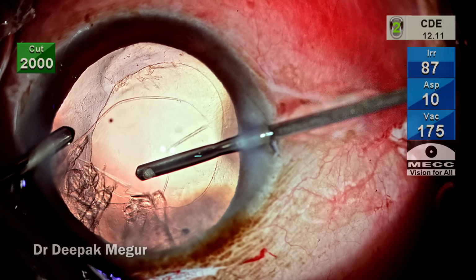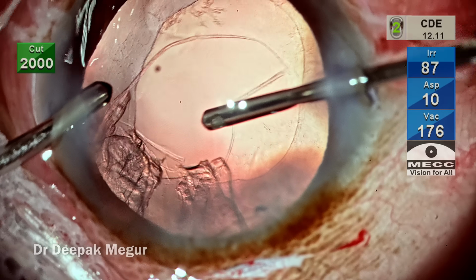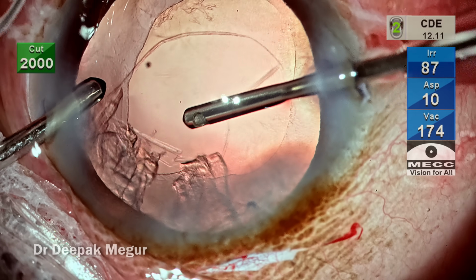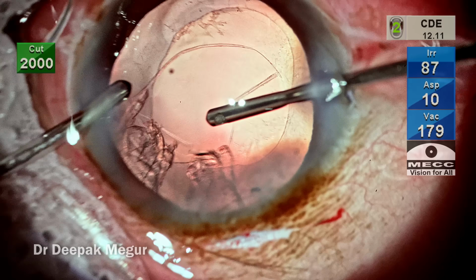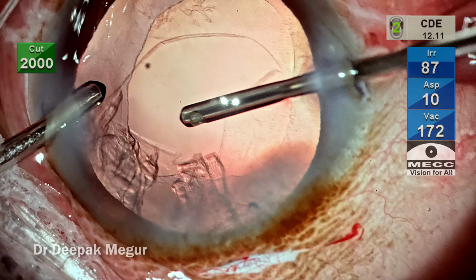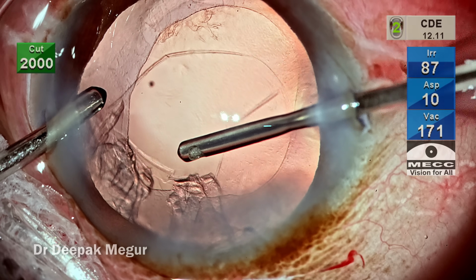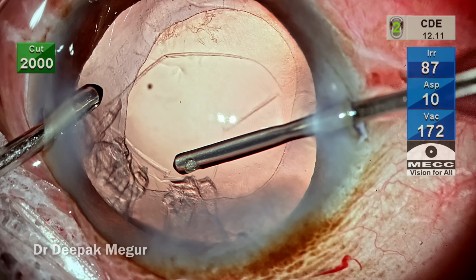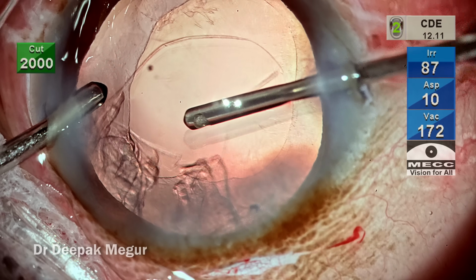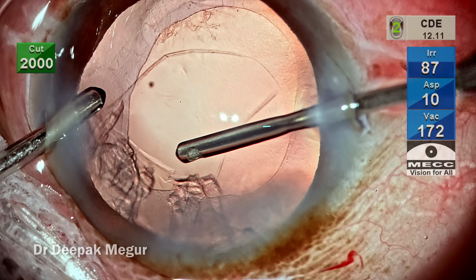before dealing with this cortex. One trick when you're trying to remove one single vitreous fibril is to change the setting from cut aspiration to aspirate and cut, so that you go in with the IA cut mode. When you go to foot pedal 2 position, you start the vacuum, which just goes and tugs at the vitreous fibril, and then you cut with your cutter. So that is one way of dealing with the single fibers. For doing the regular vitrectomy, always the cut IA is the mode to go.